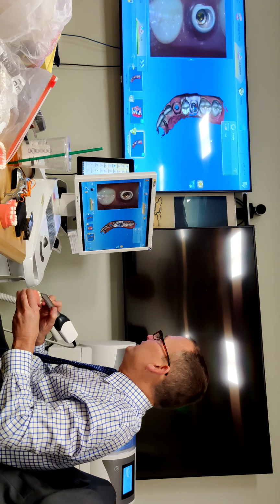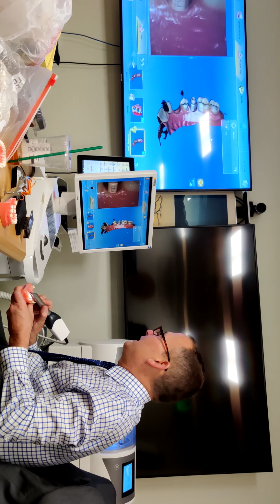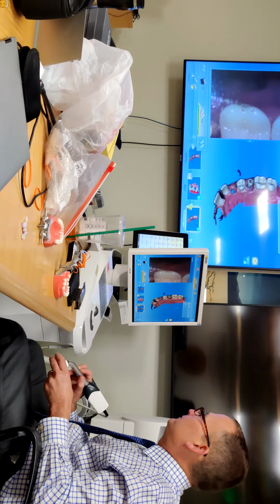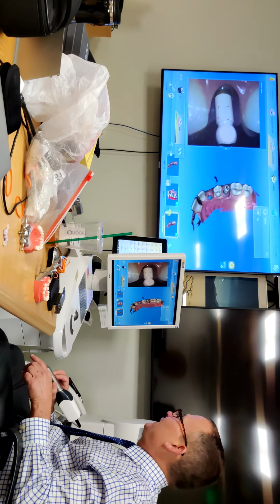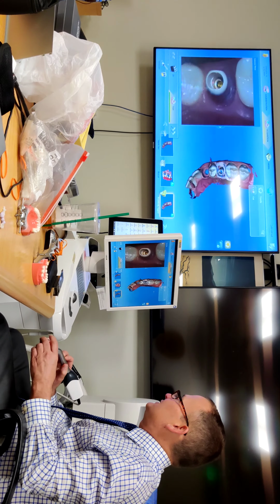What's important on this scan body is to get that flat surface, not the writing. Doesn't matter about the writing on there, or about this internal stuff. See all that internal? That's not important. What's important is that flat surface right there. Right there, see it? And the tissue.